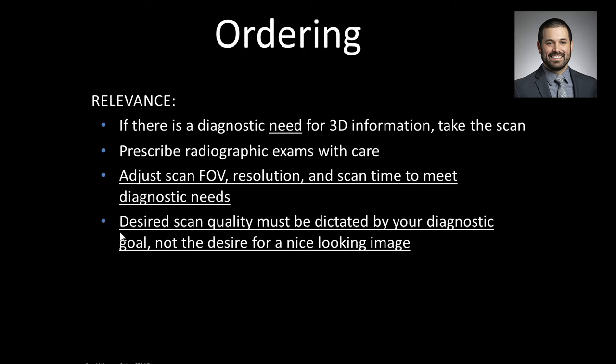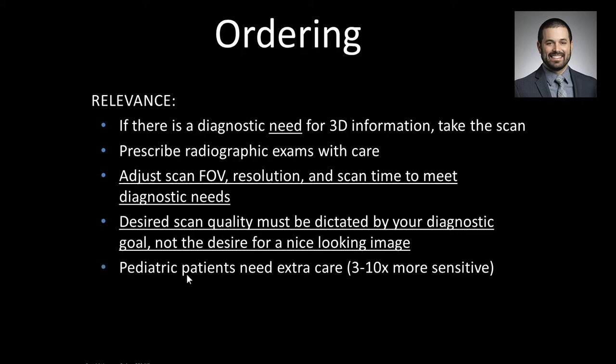And the bottom line is that your desired scan or image quality has to be dictated by the diagnostic goal, not the desire for a nice looking image every time. In other words, we get the image quality we need to figure out what we need to know, nothing more, nothing less. And we always remember that our pediatric patients need a little extra care. They're anywhere from 3 to 10 times more radiosensitive.